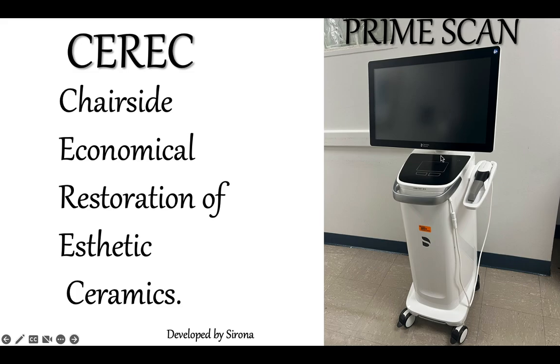However, this one doesn't have the ball, but it does have a flat surface that can be cleaned and disinfected, and it is way better than before. And the touch screen on this big screen is amazing. You don't have this one in DMD, but you're going to most likely use this in corporations whenever you graduate and start working.